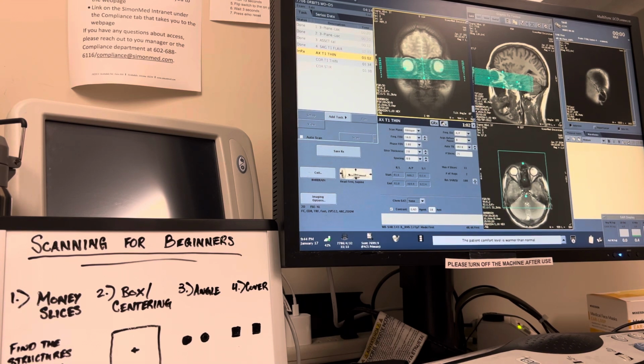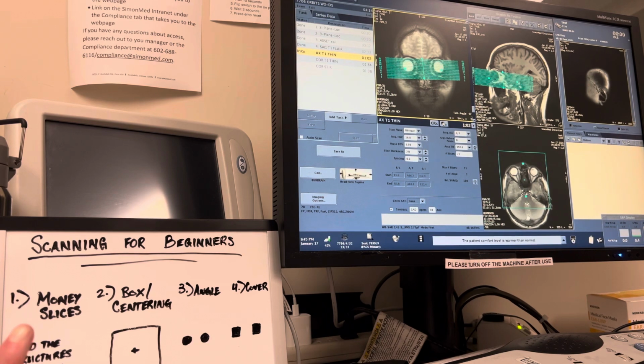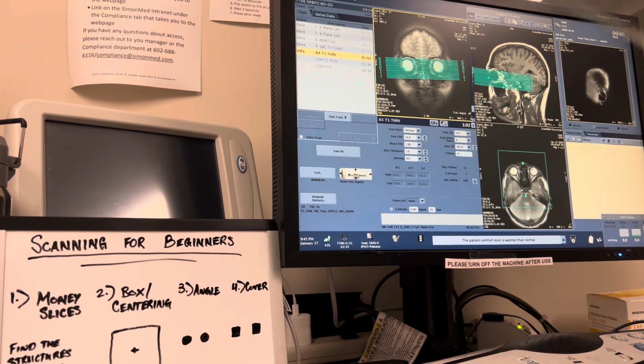Now they both basically course diagonally, or at an oblique angle, but what we're looking at is series 4, the sagittal T1 FLAIR of the brain. So in the brain, we angled straight with the brain. All the slices are like this and like that, right? So if you get one slice over here, you're only going to get a little bit of the nerve, and then if you scroll over again, you get another little part of the nerve, and that's why it looks like that. Sorry, my cat beat my hand up, so ignore all the cuts and stuff.